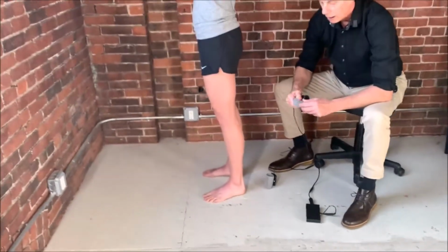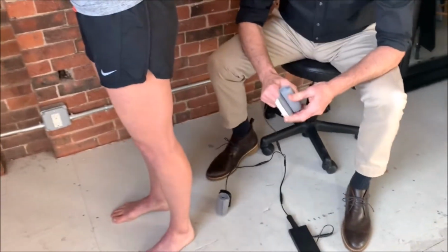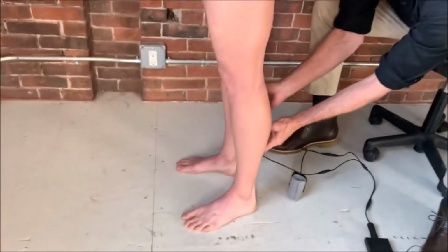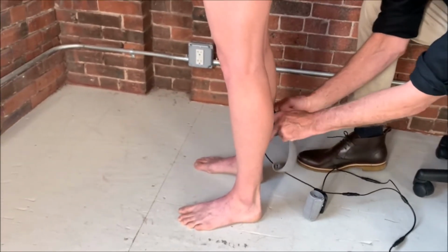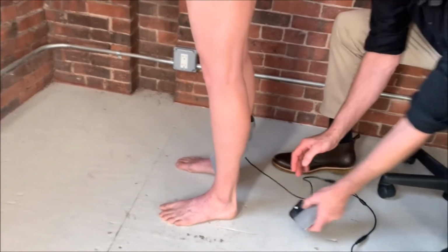So to do the test, all you have to do is take these little motors, and they come with a Velcro back. You take the Velcro off the back of this, and I like to just place it over the soleus muscle, like this, and I'll put it so the white Velcro is out like that, and then I just give it a light little tug like that. I don't wrap the whole thing around because this is just quicker and easier. I do the same thing.